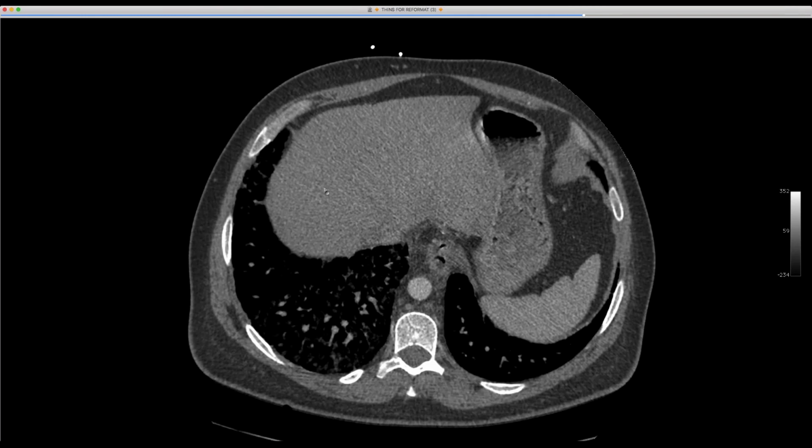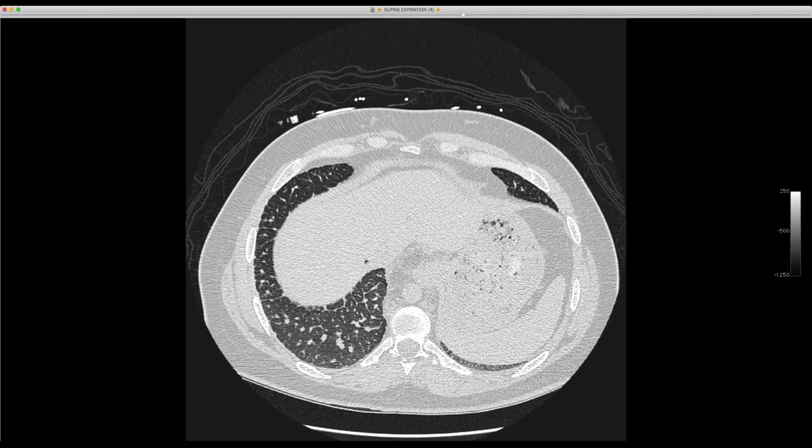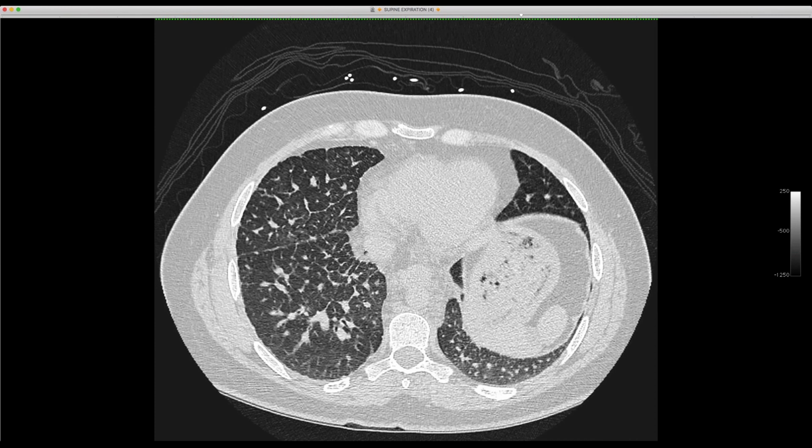He actually feels a lot better following his bronchoscopy and clearing some of the stuff out, which correlates with his CT scan from this morning, which showed that we're sort of back where we were in mid-June. He looks kind of like this now. So our thought is this is a pulmonary lymphangiectasia. So I think the next step for him is getting a lymph angiogram to see if there's a particular area, and maybe even coil him. One of our interventionalists has done quite a few of these and is very familiar with the literature on this. But I don't know if you guys think differently, but that's probably our best guess at this point.